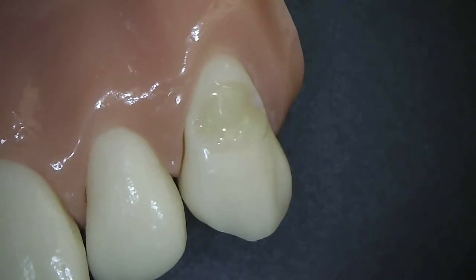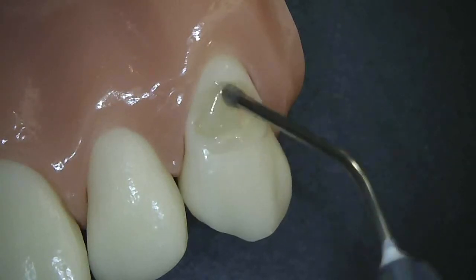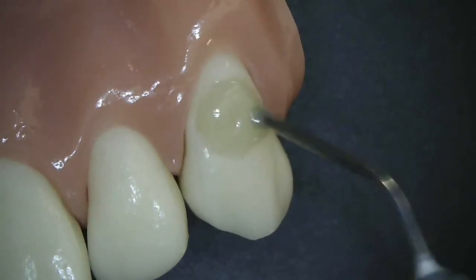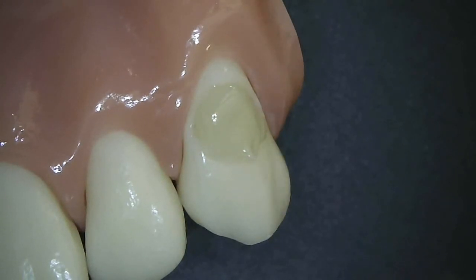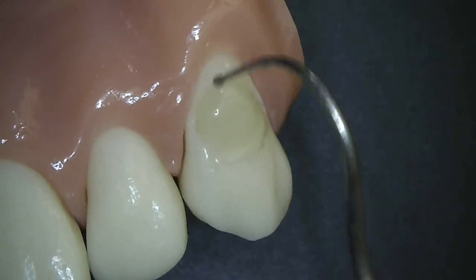And then we'll cure this, typically for 20 seconds, and maybe one more increment to get this a little bit beyond the final contour. Here too, I will advance this incisally, creating that feather edge, as well as gingivally.